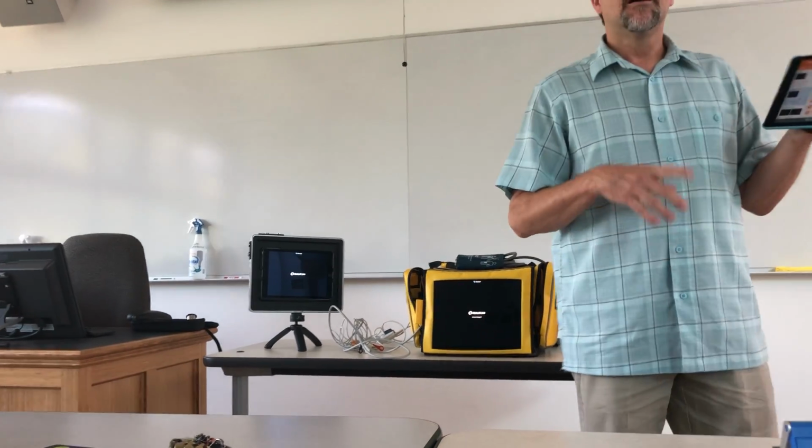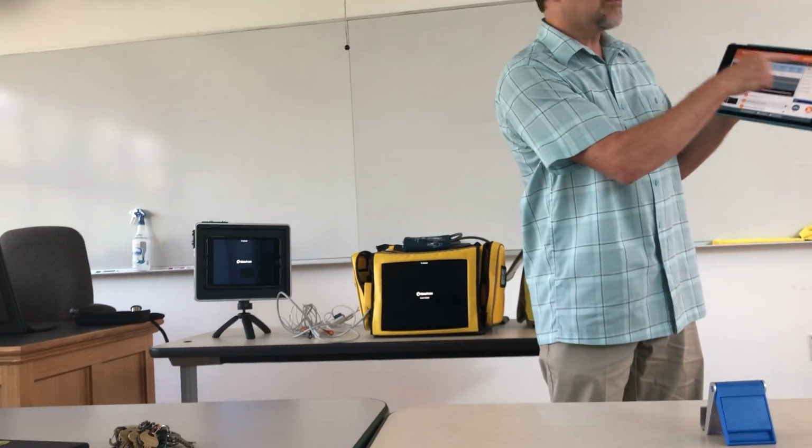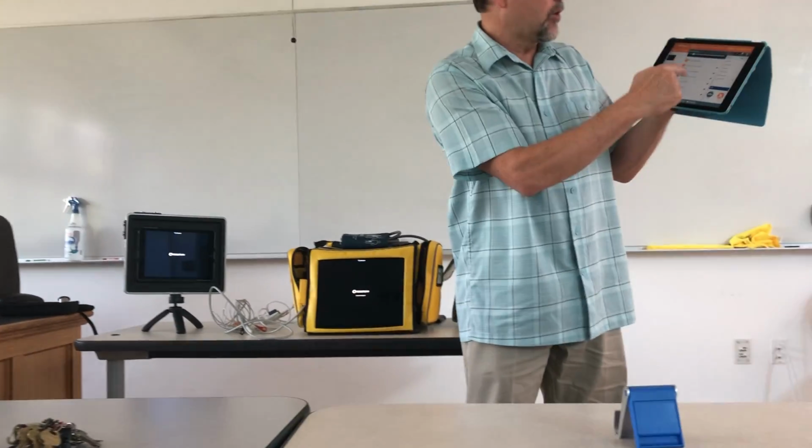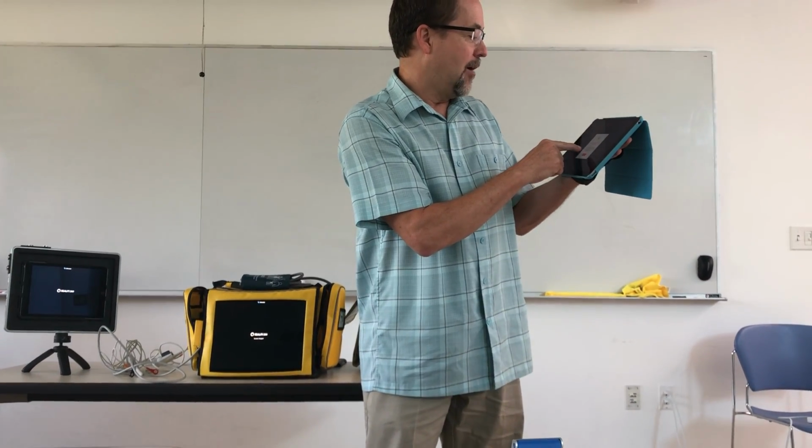I'm saying though, if they could send the summary to the student, the student can say, "Oh, these were all my vital signs. Is this my heart rate?" and all that. Yeah. There's the scenario review, which is the log, and you can hit a print review button.